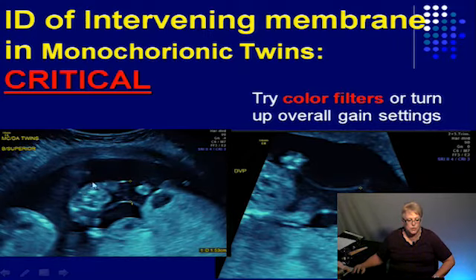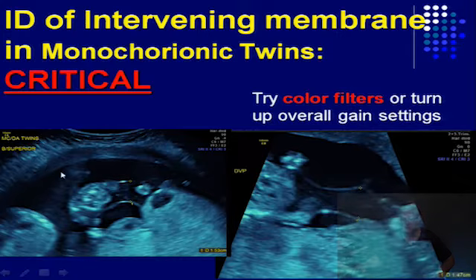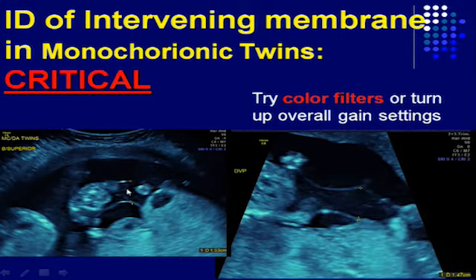See, all this fluid, the first time this patient was scanned, there was normal fluid on both babies, and I'm like, there's no way. Put that color on there, this is the only fluid that child has. All of this is from the other baby. So the one baby's sitting in one corner, barely moving, and the other one's like, whoo, I got the Olympic-sized pool, I'm moving everywhere.